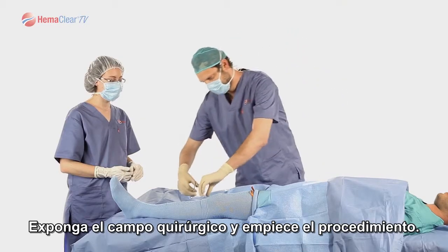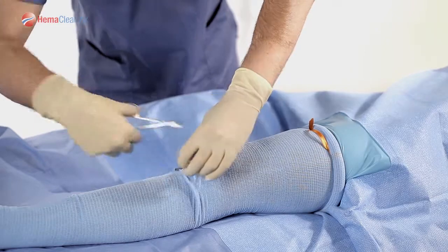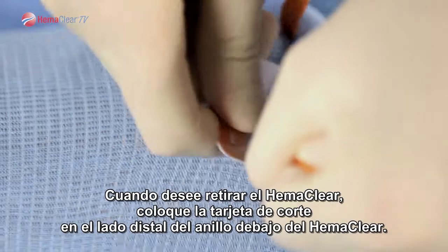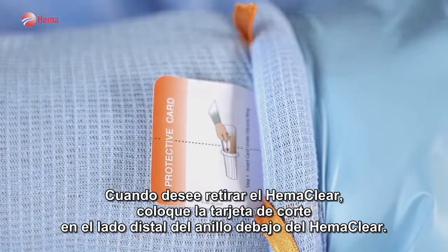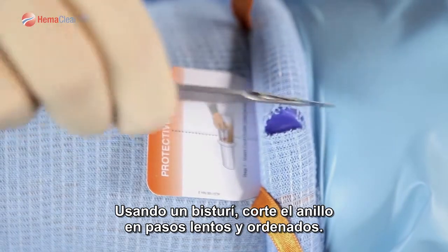Expose your surgical field and begin the procedure. When you would like to remove HemaClear, place the HemaClear cutting card from the distal side of the ring under the HemaClear. Utilizing a knife, cut the ring in slow orderly passes.